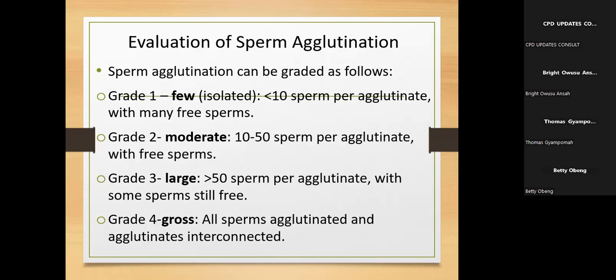So if somebody wants to start the extra tests, firstly, you may have to invest in that and do semen analysis as a project of a sort, and look out for cases that contain sperm agglutinates. When the sample contains sperm agglutinates, then your first suspicion is that they could have anti-sperm antibodies. Then for all those cases, you do your immunobead test, and then you publish it: that a number of the cases of infertility are due to anti-sperm antibodies. Therefore, your recommendation is that apart from the routine semen analysis, people should also be interested in doing the anti-sperm antibody tests. And then you see that now you'll be driving the market. Before you say that everybody is doing anti-sperm antibody tests, there's a market for it, and the people will now bring it in. Otherwise, the situation as it is, I'm afraid the supplier or the market will not be available for some of these things. I hope I've made my point.